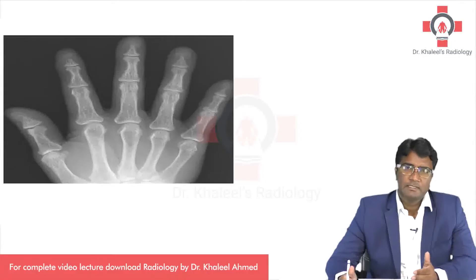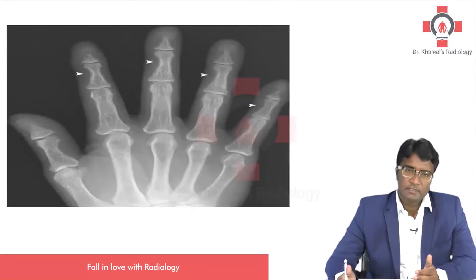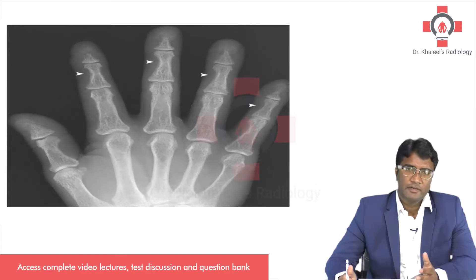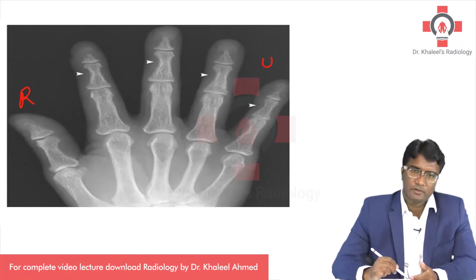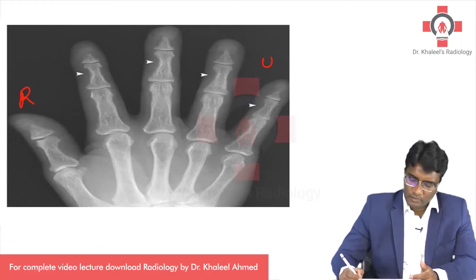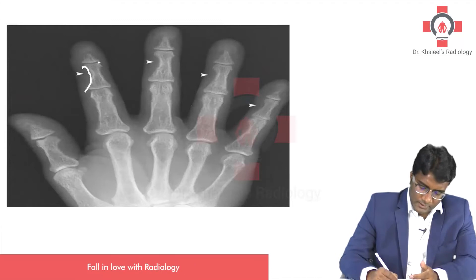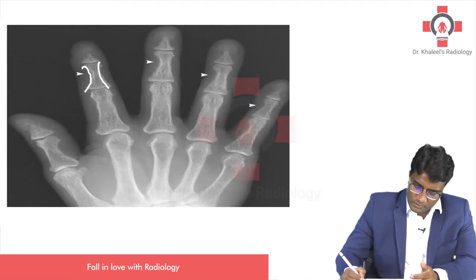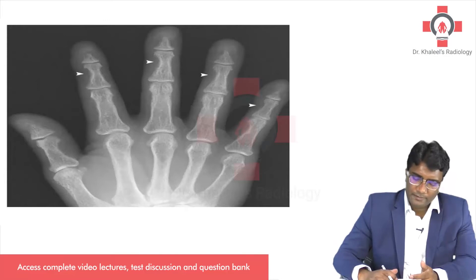In this hand radiograph, we see that there is erosion classically involving the radial end of the middle phalanx. If you can see this image, this is the thumb, this is the radius and this is the ulnar aspect of the digits. You can see those erosions classically involving the radial end of the middle phalanx — this is the radial end, this is the ulnar end.